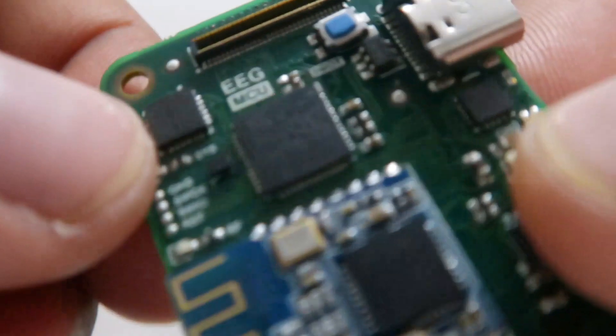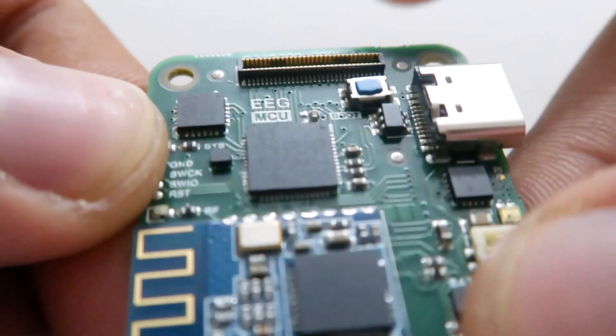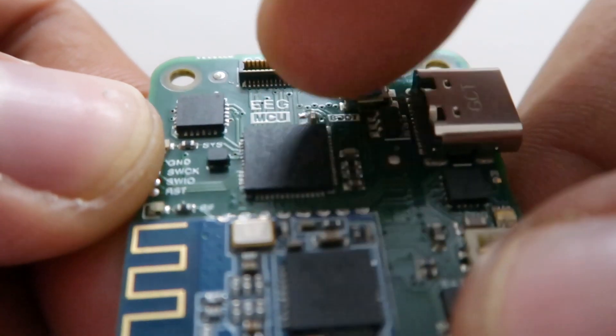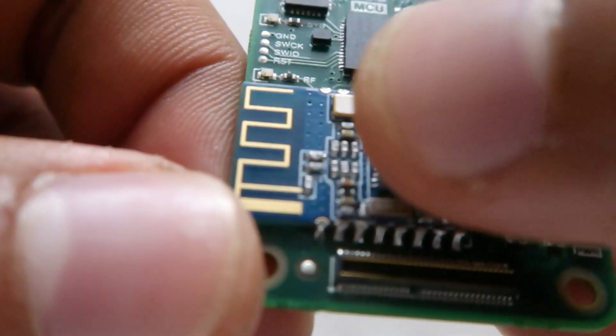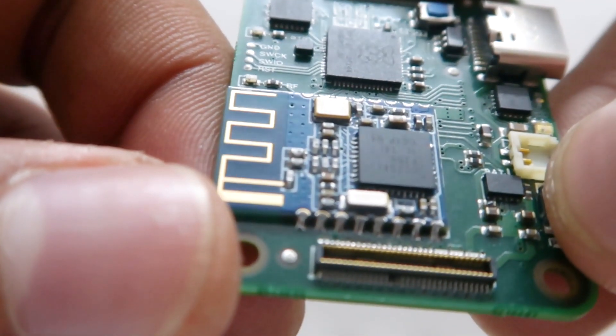On the MCU board we have Raspberry Pi's RP2040 as the microcontroller, the MPU6050 as the IMU, and for BLE communication we have an HM11.